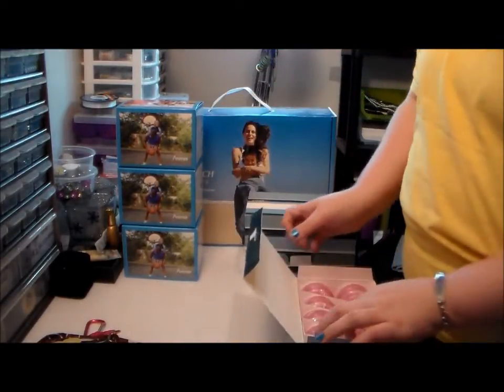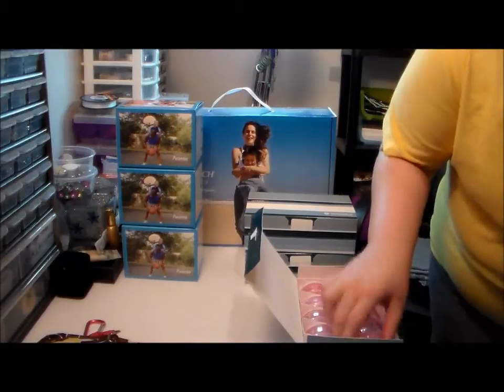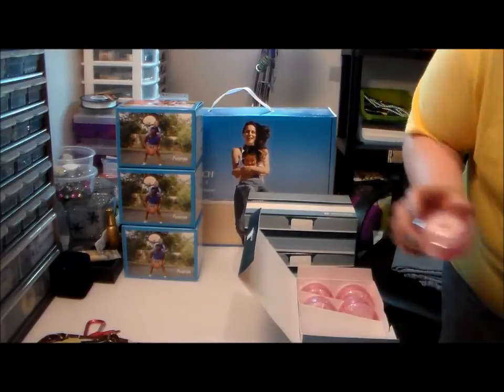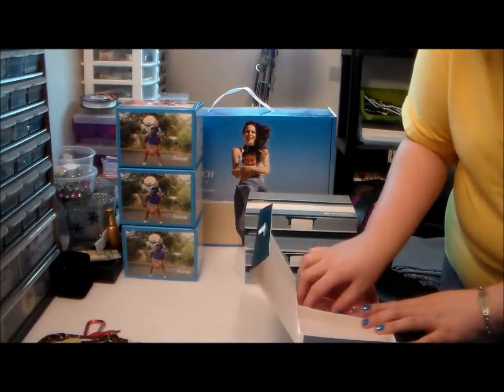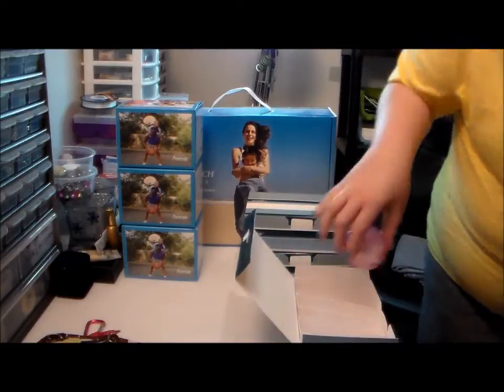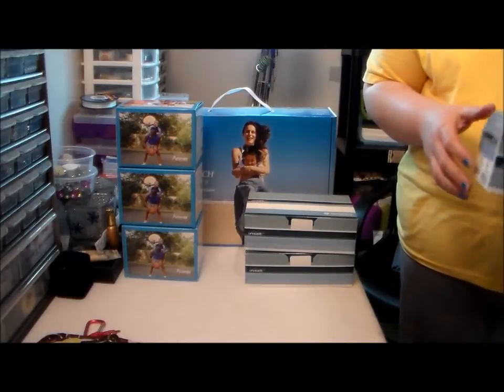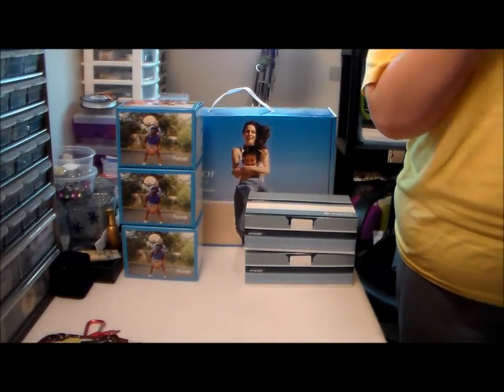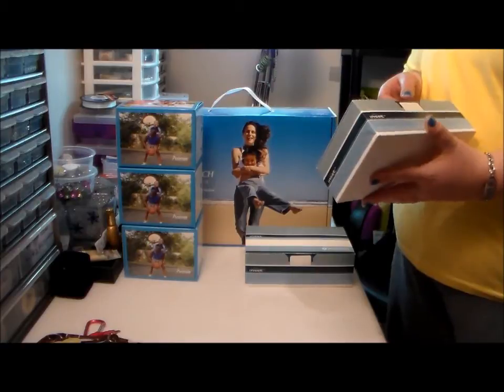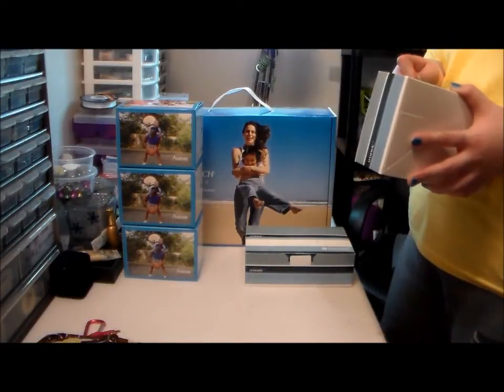I've already got my drawers for storing all of this — you can get them at Walmart, Target, or Kmart. They're the plastic drawers on wheels. I've got like four or five of these. Excuse me for the sniffling. I guess I shouldn't care about ripping the box, but it's gonna get torn up anyway.